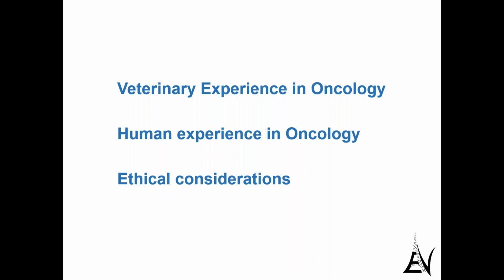There has been a learning curve since then in the veterinary field about radiation therapy. So what we do today with orthovoltage might be a little different from what Alice was doing, but she was at this time already practicing, for instance, intra-op radiation therapy with orthovoltage. She was using it for palliative treatment of bone cancer, etc. So there is some experience in the vet field with orthovoltage, and most of the articles, unfortunately, originated in the 80s and 90s. So whether or not we can rely 100% on these articles, I don't think so.